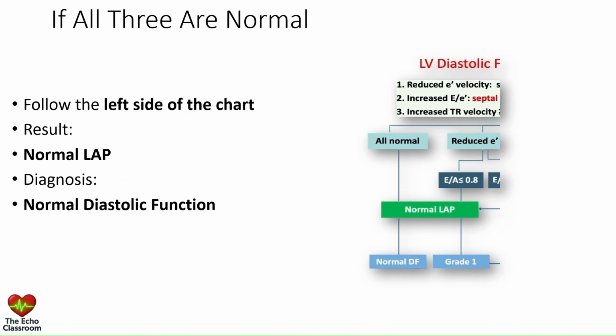Case number 1, if all three are normal. So if you have normal left atrial pressure, it means normal diastolic function. If all the measurements are normal, you stop here. The patient has normal filling pressure.